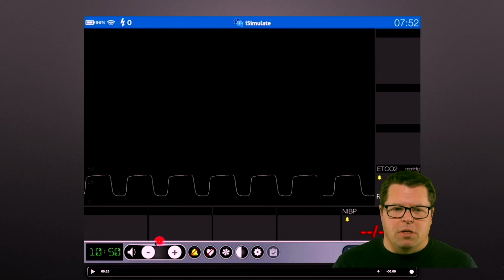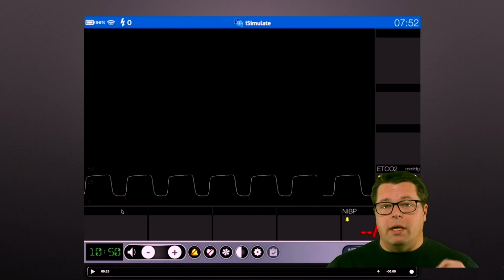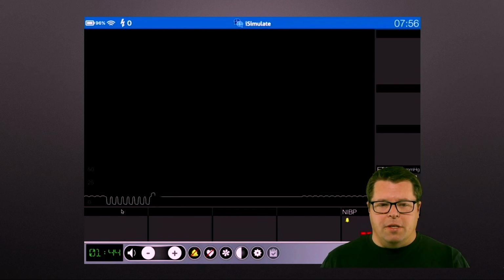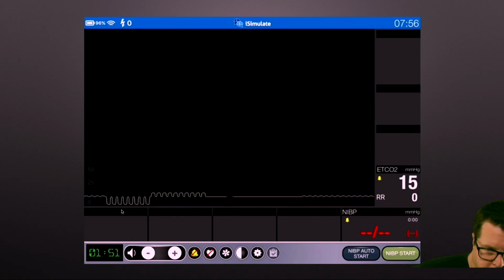Now again, some tubes, you have to watch the scale on it. Some tracings may kind of just look this way and float in the air, but they should go all the way back down to, again, pretty near zero each time. And how about this little thing here? I've seen this happen a couple of times. Somebody comes in, patient is in arrest, and the EMS crew says, yep, have end tidal on, getting an end tidal of, whatever I said here, 15.